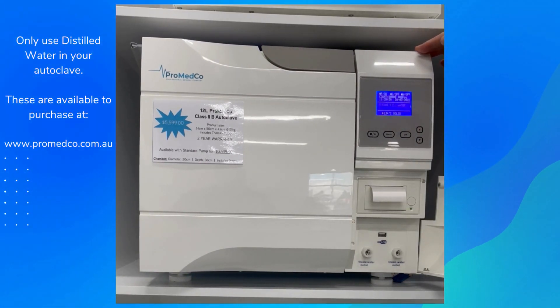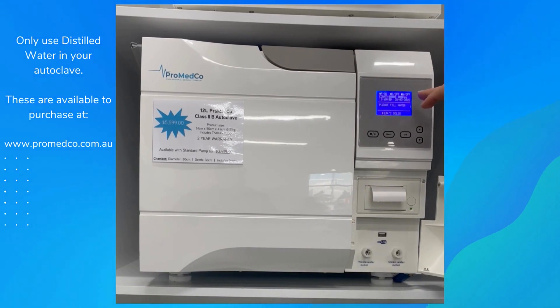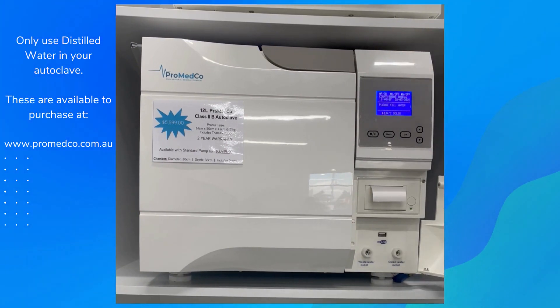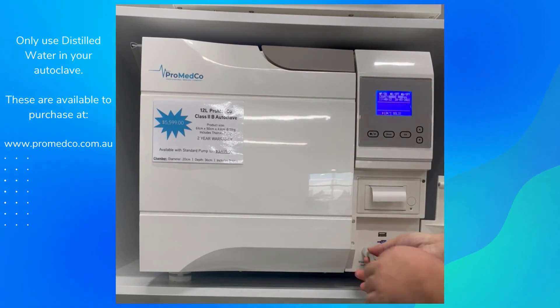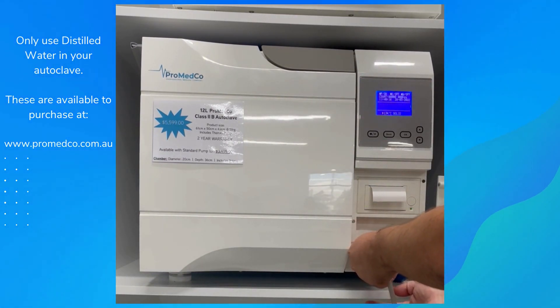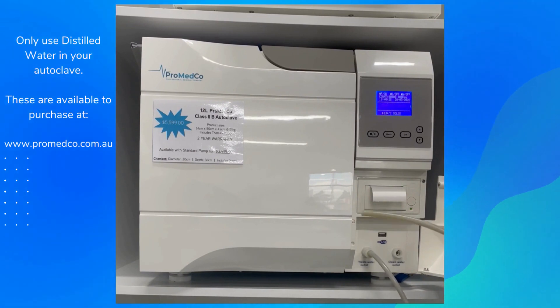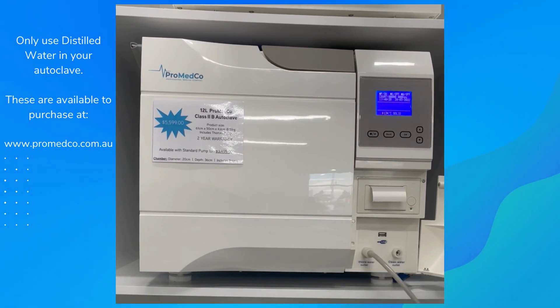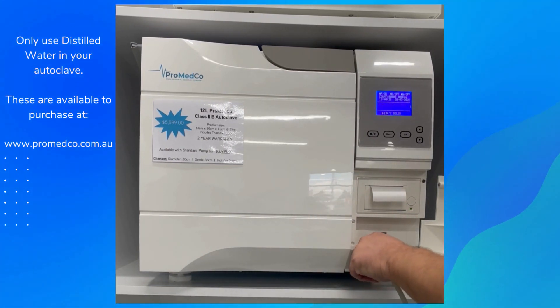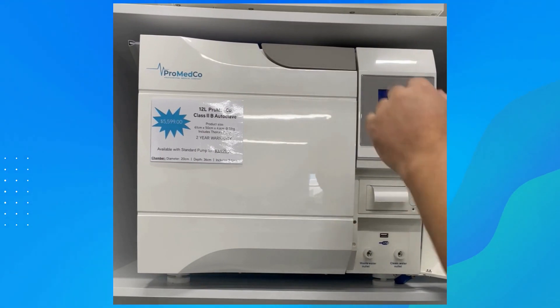This autoclave has an internal waste water tank and a clean water tank. When the machine prompts you to empty or add water, you add clean water through the top. To empty the waste water, use the tool supplied with your machine — insert it into the slot here and turn it to the left. It will automatically start draining into a sink or a bucket.